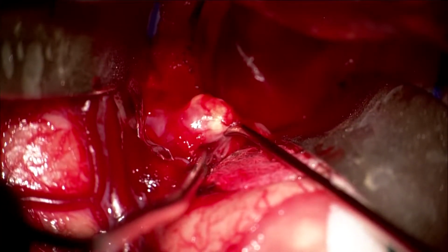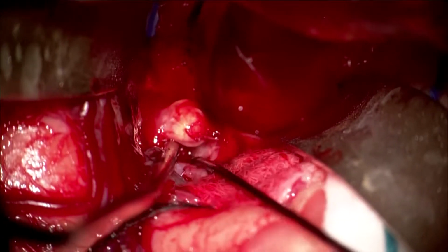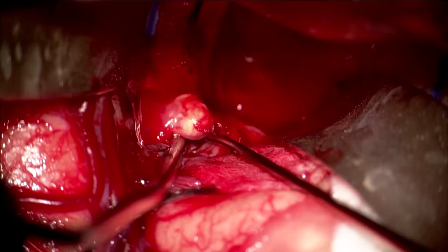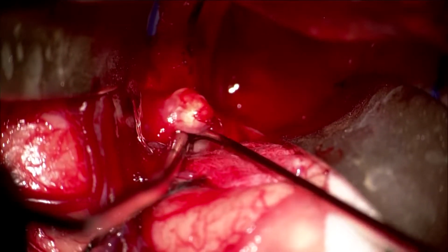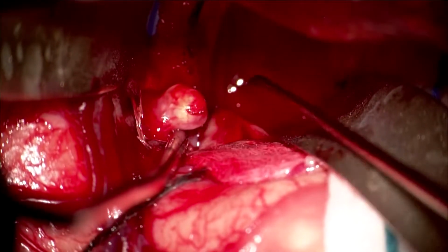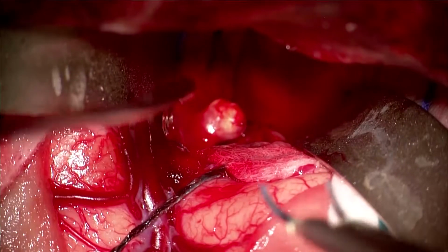Now, once again, dissecting and identifying the neck of the aneurysm, creating space between the normal brain and the aneurysm neck itself. Once we have circumferential exposure of the aneurysm, then I can feel confident that clip placement will be as safe as possible. So at this time, the aneurysm appears to be completely free of adhesions, and a clip can be placed.